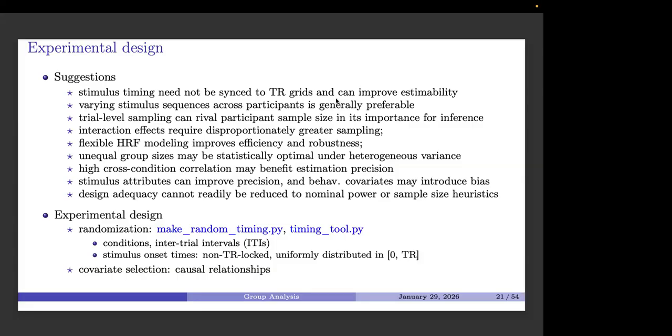So I guess the spatial variability doesn't come into the equations in the same way that cross-trial and cross-participant variability does. There isn't a factor of cross-voxel variability, and that's dealt with, as you say, in this different way, either massive univariate or some kind of spatial relatedness of all these individual tests. Maybe that's why it's treated a little bit differently, but it certainly has important consequences, just in a different way that can't be put on par with the other two.